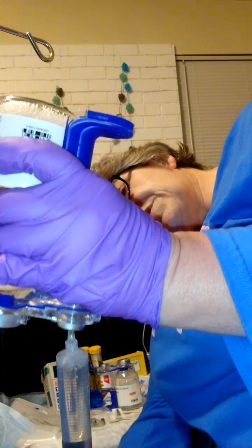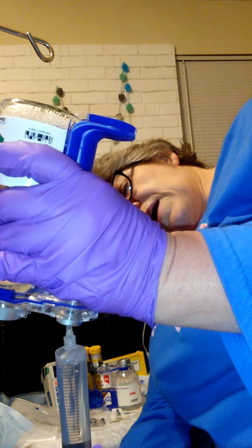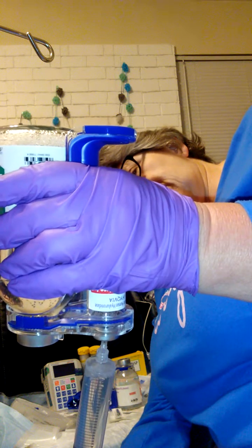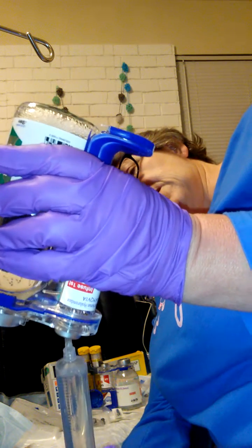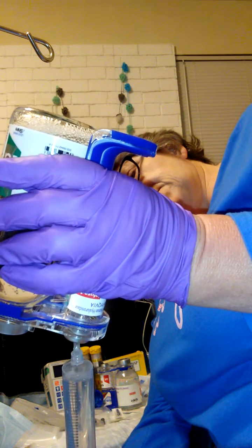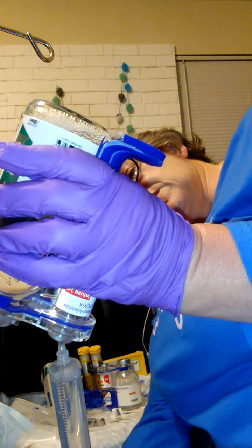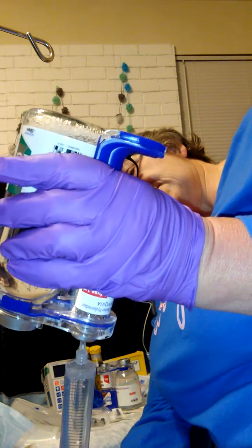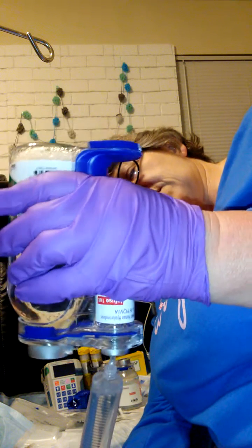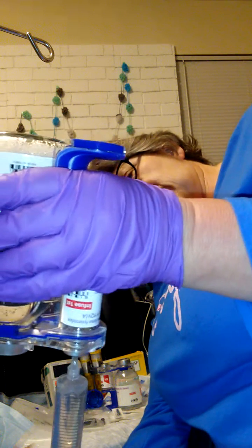This is very important in getting your soft tissue ready to receive all of that other liquid. So this is like a plumping solution. I consider it like a little plumping solution that will cause your skin to raise up and make room for what you're getting ready to put in. I think we have about all of it out.